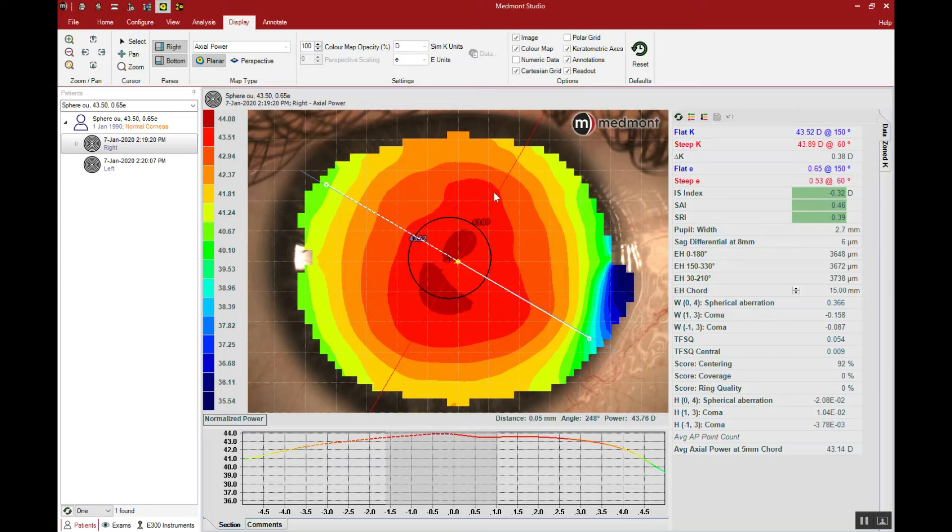What else can we observe? Looking at the peripheral cornea is an important observation because it will explain whether we need a toric or symmetric landing. One important value to observe is the sagittal differential at eight millimeters. This looks at the height of the flat meridian compared to the height of the steep meridian to tell you how toric the peripheral cornea is in microns. In this case, the difference between the flat and steep is only six microns — this is telling us that this peripheral cornea is incredibly symmetric, with very little toricity.